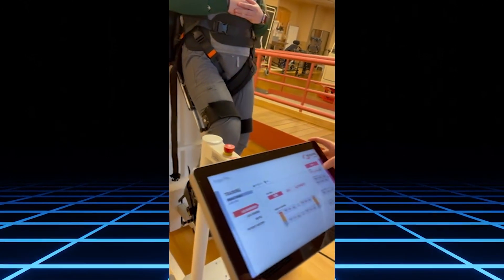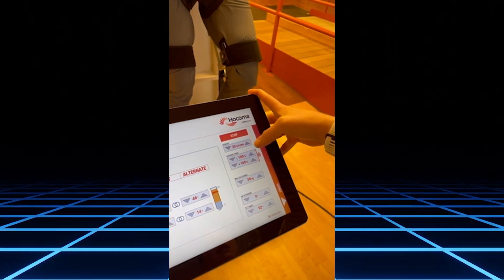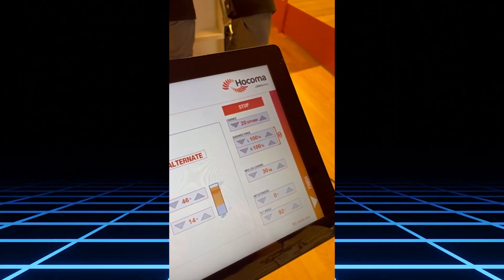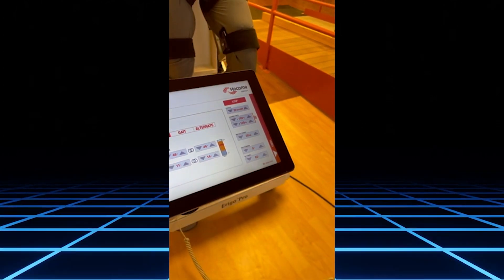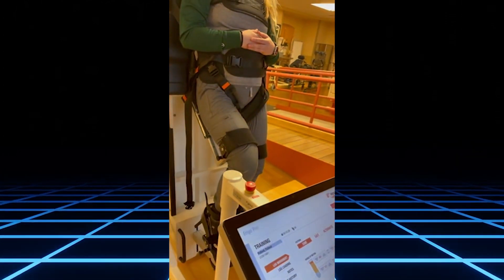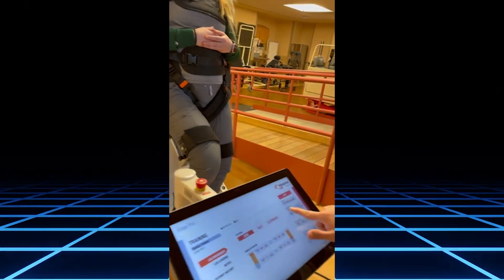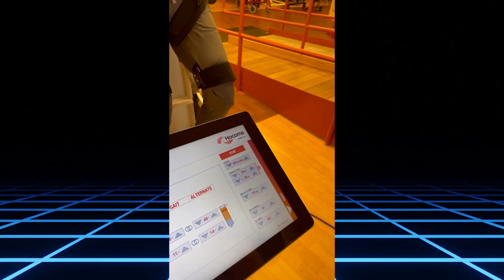If you'd like to change the cadence, you can make it go faster. Guidance force is how much work the patient is doing. Currently the machine is at 100%, meaning the machine is doing 100% of the work. If you wanted the patient to do more activity along with the machine, you would decrease the guidance force and have the patient help with the movement.